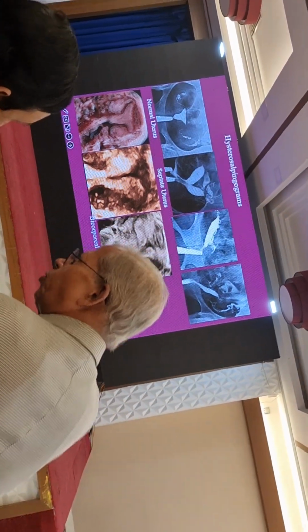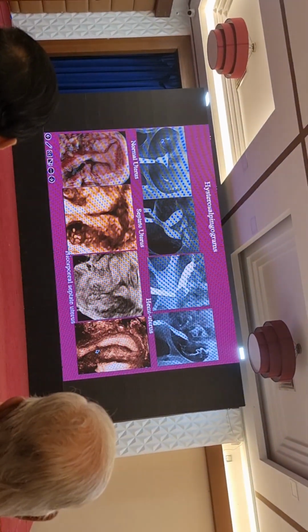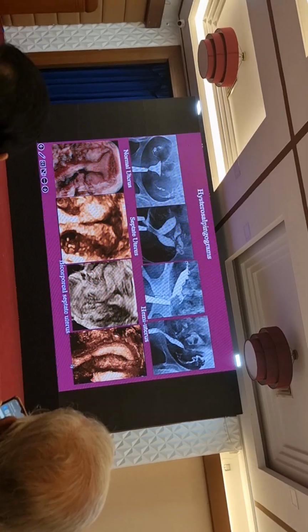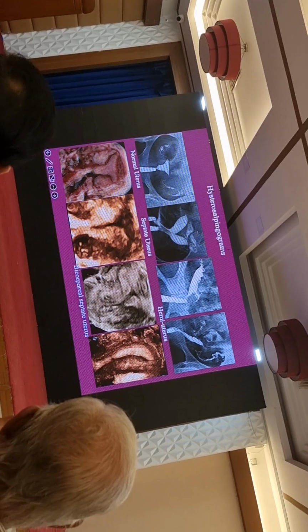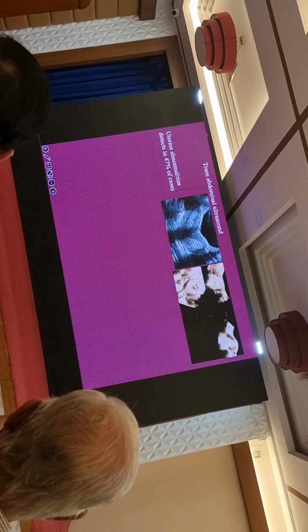So this patient actually would have benefited if we had tried doing this, but I'm very against that unless we do a 3D, because in this particular patient it looked like a didelphys uterus, and this was in earlier days, and we used to have the OBGYNs come to insert the cannula. And so she insisted and I refused, and I'm glad I refused because I don't know how much damage she would have created if we had gone in to put the second cannula.